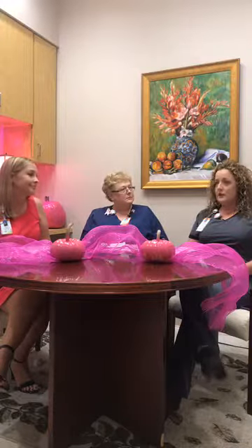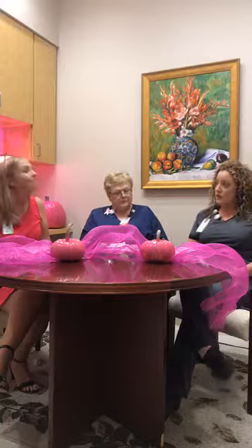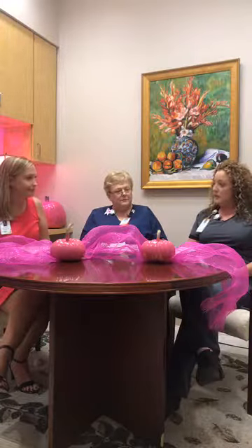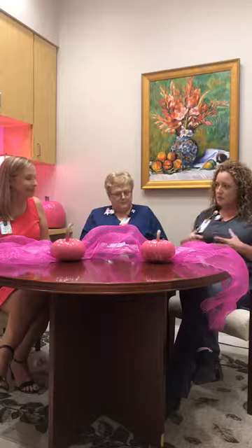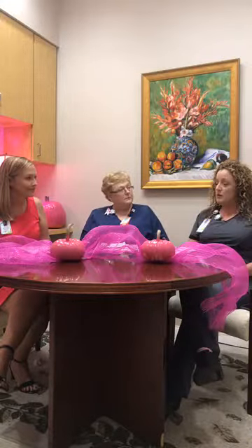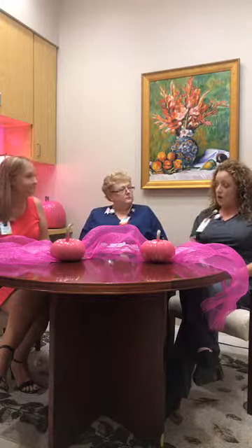When you get here, you're going to fill out some paperwork. It's really important for us and for the radiologist to have history on you, as far as anything going on with your family, your personal history, that kind of thing. So you've got some paperwork to fill out. But that's important because it tells us about you and it tells the doctor about you.